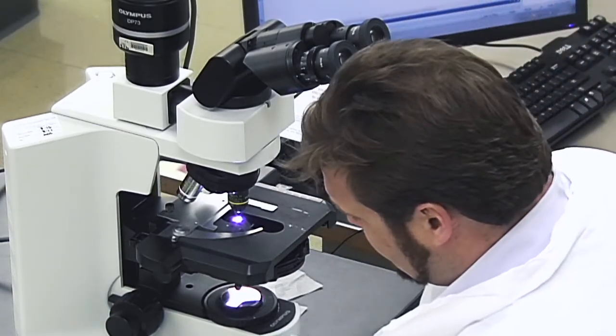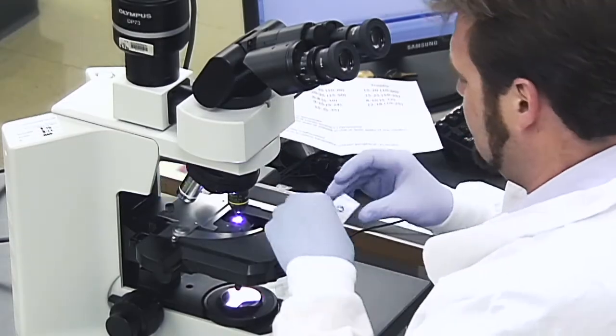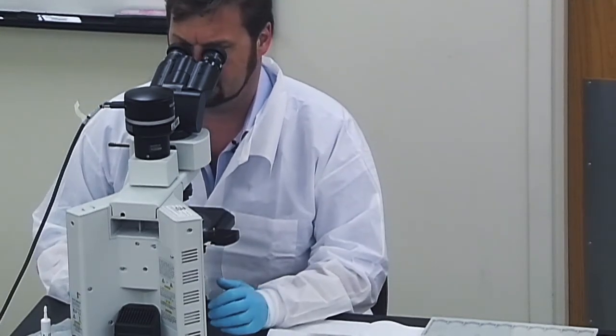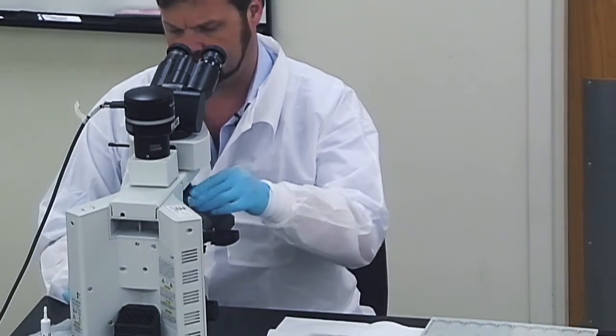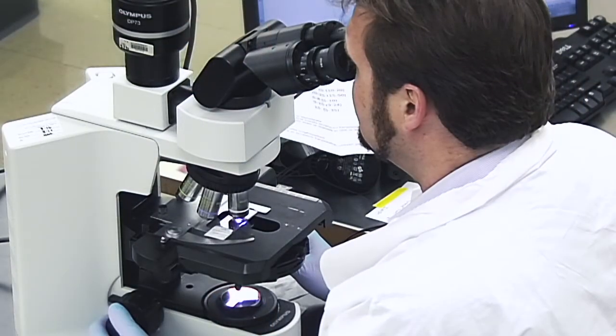Let's show you something else here. Here's the third most common Entamoeba of humans that you're going to come across in specimens. So let me just focus my microscope. I'm looking at all these stain preps under times 1000 magnification. I like to look at them under times 1000. If you've got a times 600, you might screen with that and then zoom in on times 1000. But this is what I tend to use for my routine purpose.